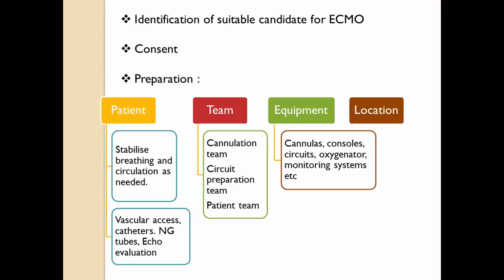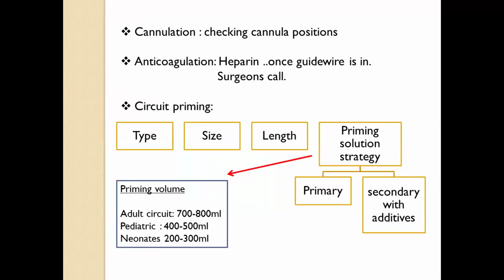Like Dr. Deepanjan said, if you're doing central cannulation, you may have to take this child to the OT and do it. Well, if it is a peripheral cannulation, maybe it can be done at the bedside. Sometimes we do ECMO transports where we have to go to the site while we retrieve patients, and that may be the site where we have to do the cannulation, initiate ECMO and bring the patient. So a lot of preparation goes on, and it's a very tedious and laborious process. If it is done right, then we get things correct.